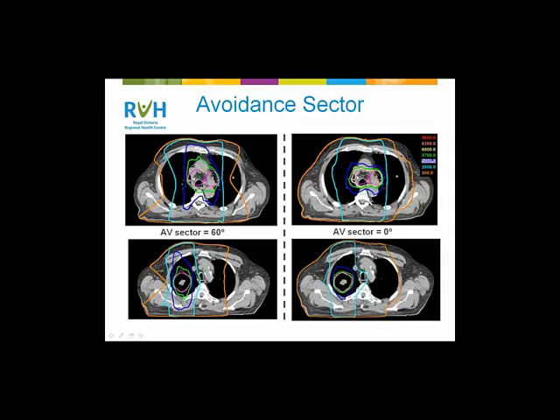There's a lot of great comments about 18 MV here, and definitely we recognize that. Also to keep in mind, there are two competing effects going on here. We're treating the mediastinum as well in a lot of these patients, and that's where the patient is thicker. So when we prescribe to the middle of the field, we tend to get MUs that give a dose covering that region fairly well. Then when we go off into the lung, where buildup might be more of a problem in the tumor, you're already giving more dose in that area in the base fields because there's less density along the path length to the tumor. So there's a little bit of balancing going on with that.